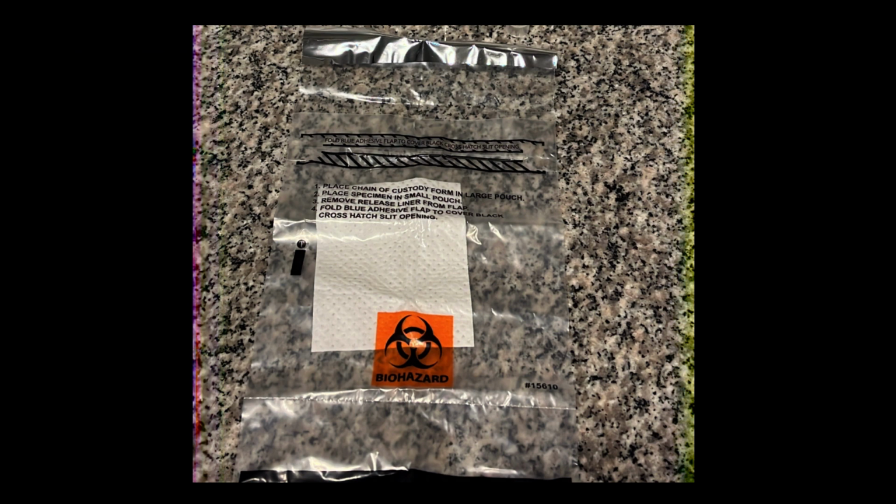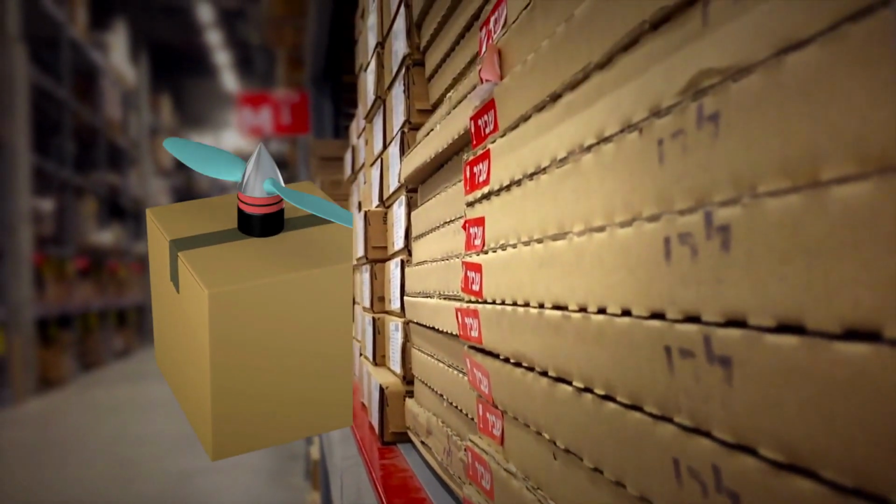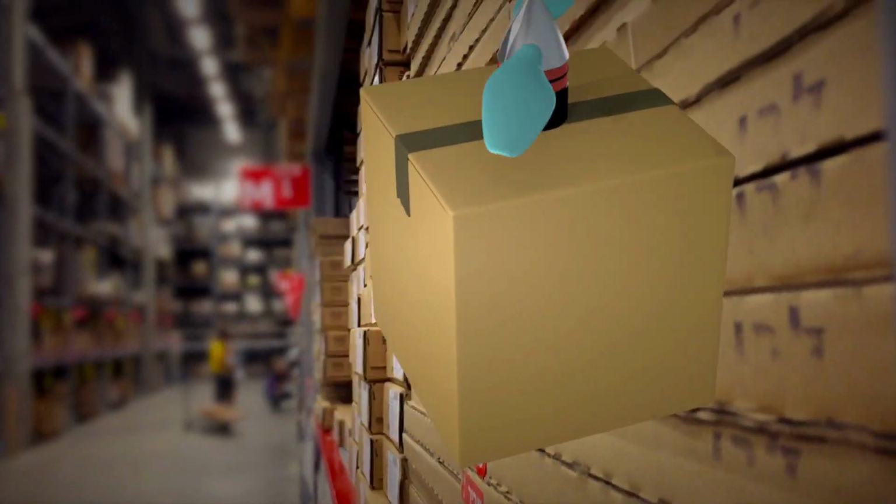Then you put your chain of custody and your specimen into the transport bag. Chain of custody goes into the big pouch and specimen goes into the smaller pouch with the absorbent pad. Then you remove the adhesive and you close it shut. Then you take your completed specimen transport bag that's completely sealed and you put it off to the side and get it ready for shipping back to PSI.